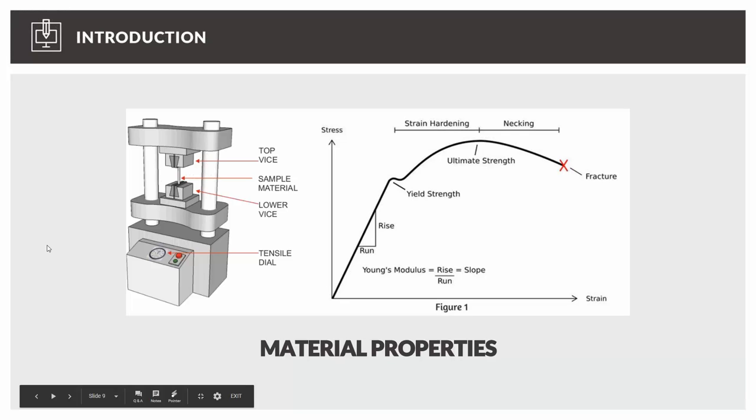All right. Okay. Now let's talk about something very important. Here the question is, if I'm expanding the balloon with the stent, the stent is also expanding. But when I remove the pressure from the balloon, the stent stays at its position. What's the reason? To understand this, let's take a look at this very fundamental material test, which is called the stress-strain experiment, or maybe some of you know it as the tensile experiment, and it's used to characterize different materials.